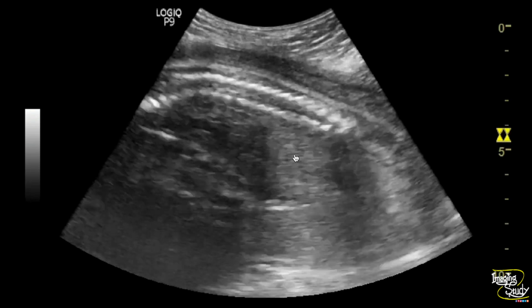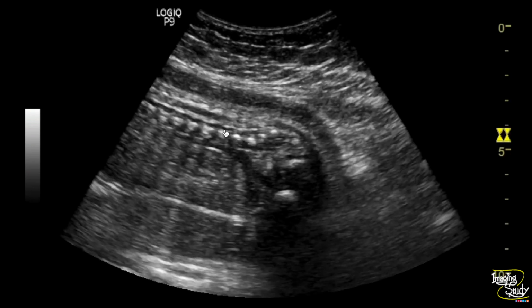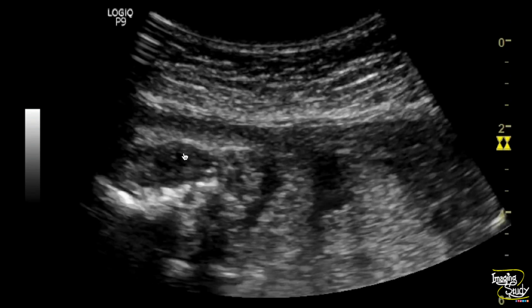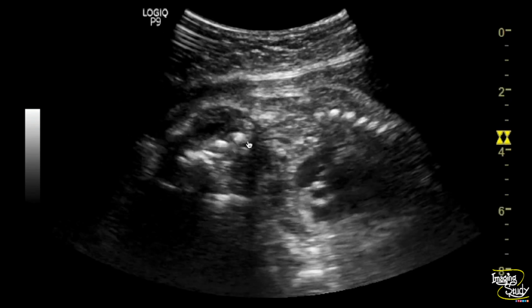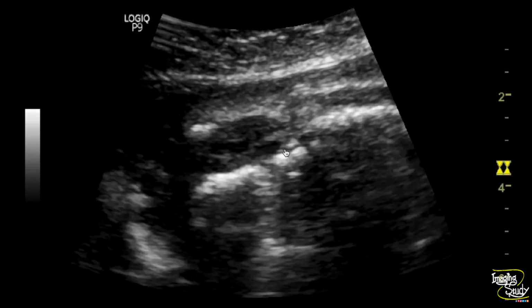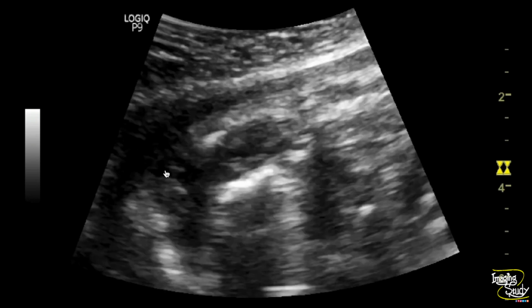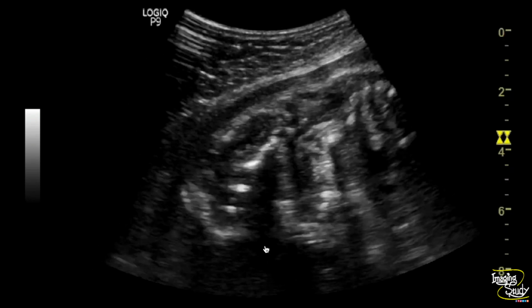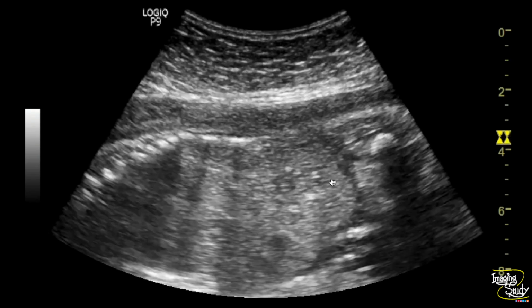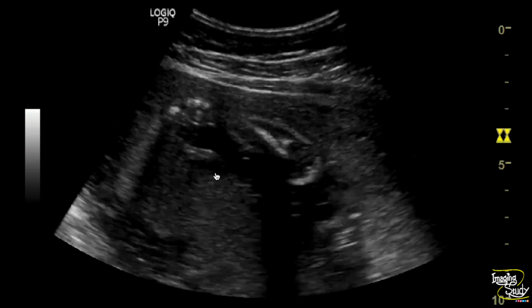Now we jump into the fetal spine. The spine looks quite normal at the lower part. But when we are tracing the cervical region, we see a focal splaying of the spine at the lower cervical part. Overlying skin looks quite intact. This area is the spina bifida. These are the forearm bones.